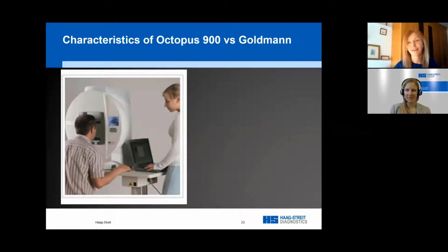I remember in the very early days, some clinicians saying, but the colors are different. We always used blue for the I4e, but in actual fact, you just said it's a computer. You can change the color for your stimulus sizes. So all of that remains the same.